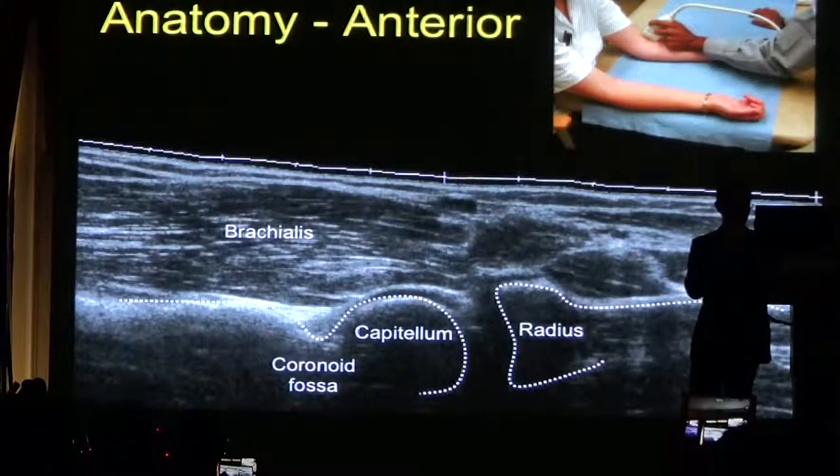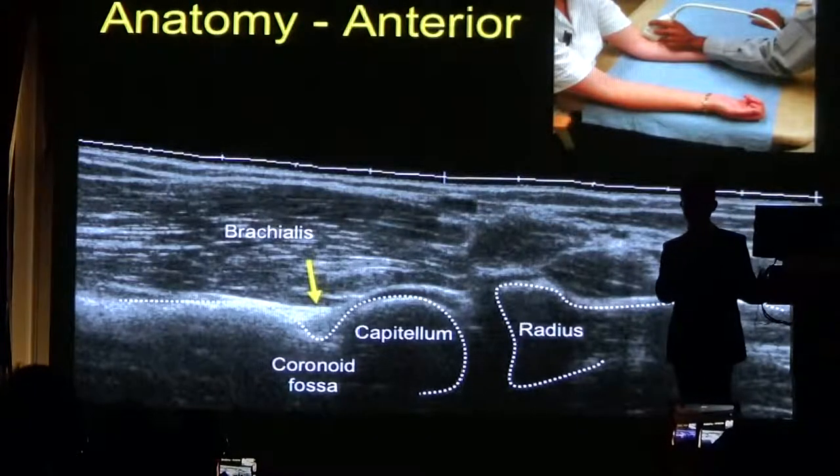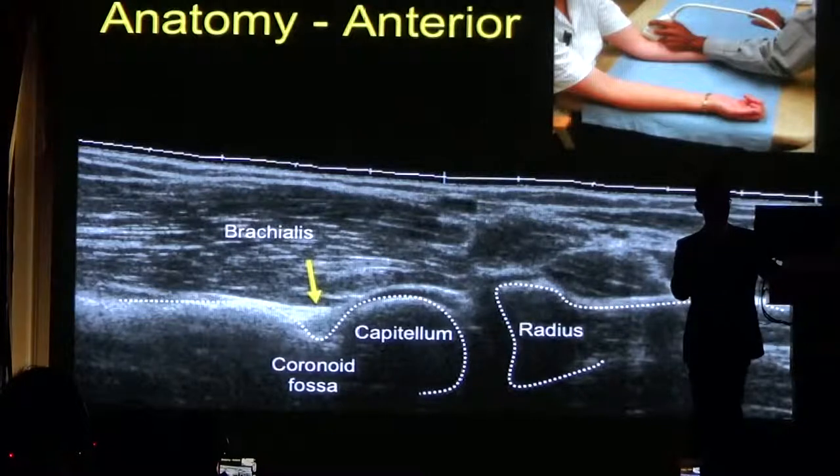You can see the capitella demonstrated here, and you can see the coronoid fossa with echogenic fat within it. Remember, on an X-ray, if you have a joint effusion, that fat pad is pushed anteriorly, giving elevation of the fat pad. So what we're looking for is fluid that lies beneath the fat pad.